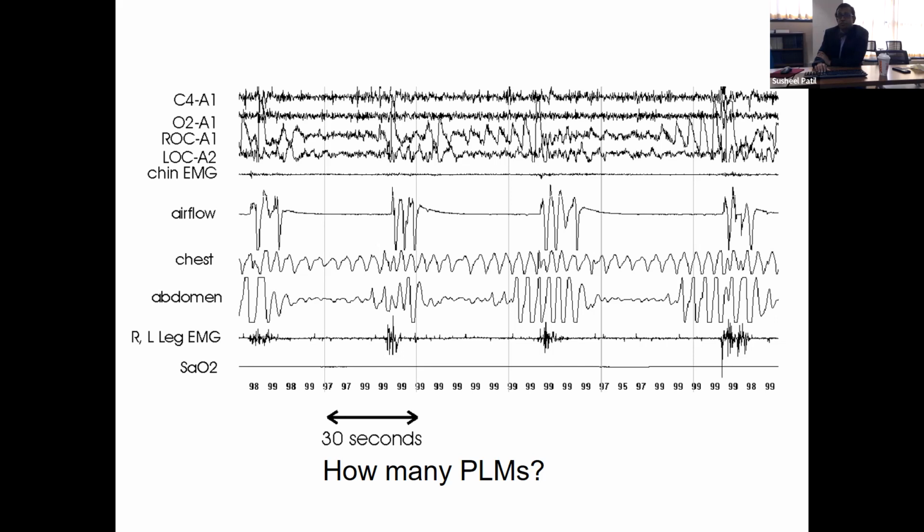Now, what you can do, at the very least, is qualitatively, in your sleep study report, you may not count these, but if you had that situation, Rick, you could put in a statement that you suspect the leg movements could be inducing an arousal-based set of respiratory events, something qualitative like that. But to Dr. Stroll's point, ultimately it's an intervention that's going to help you delineate whether those are true leg movements or not.